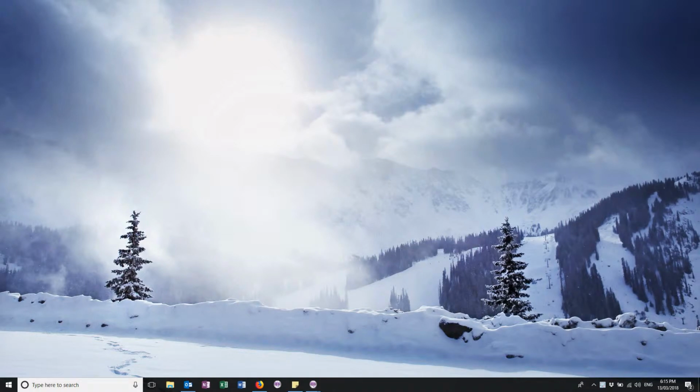But when you start the session, there are no beeps and the screen isn't changing, so therefore there is no feedback for the client. Now, assuming that the session has actually started, so you've pressed F5 because sometimes people forget to start the session and obviously there will be no feedback, and you have adjusted the thresholds correctly so that there is actually feedback to give, and the initial way to adjust the thresholds is to press F11.